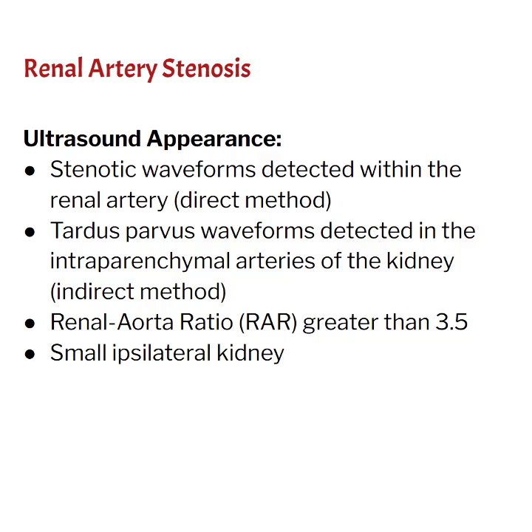And another thing that we might see, probably more commonly in the general lab, is that when the blood flow does not flow to the kidney as it should, that kidney starts to become small and echogenic. And so that might be something that we notice during our abdominal exam, our liver exams, right upper quadrant exams. And because we know the basics of renal artery stenosis pathology, we might actually be able to figure out that this patient needs a dedicated study to rule out renal artery stenosis.